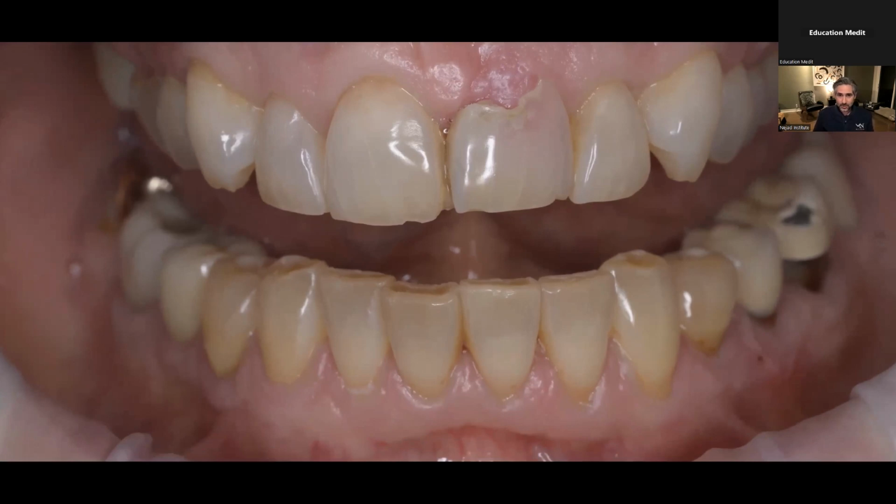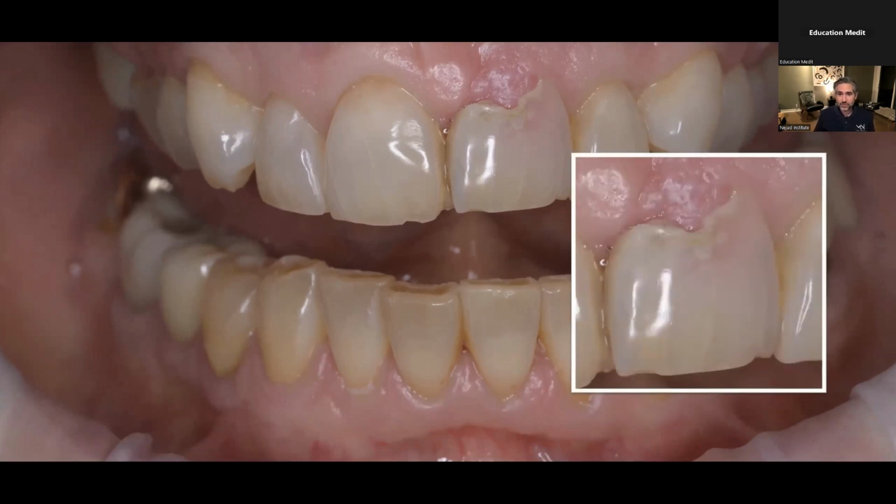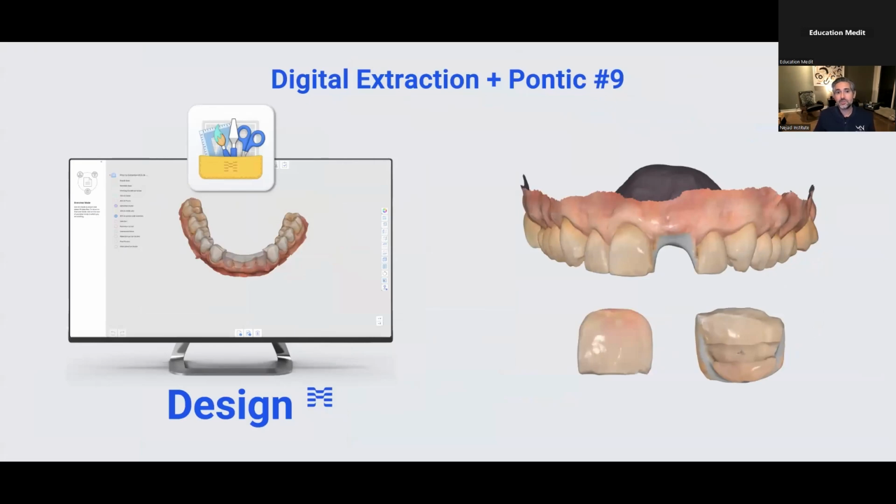So we have this resorption, and of course, the tooth is unrestorable. We have this evaluated with CBCT, referred to perio, and it's just pretty obviously understandable that restoring this tooth is not an option. So, after consultation with both the periodontist and myself, we are preparing for the first thing she's going to get. And generally, the most predictable and smoothest is for me to deliver an Essex with a composite tooth in there. And more recently, skipping the composite tooth, but doing a 3D printed pontic has been something I've really enjoyed.